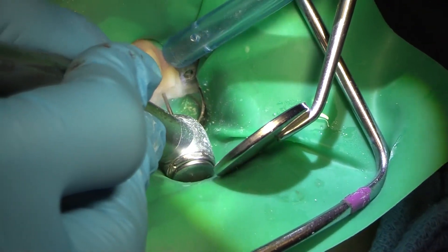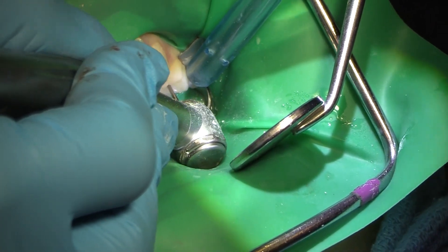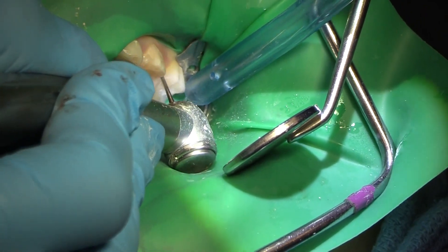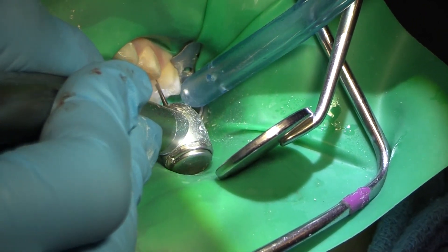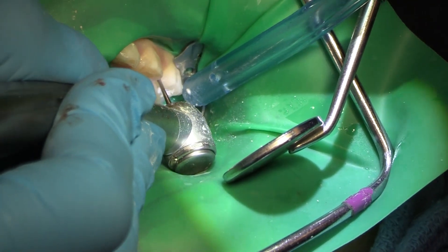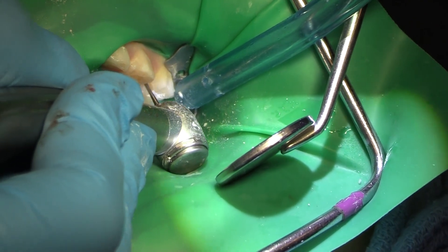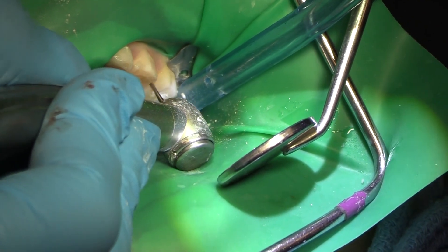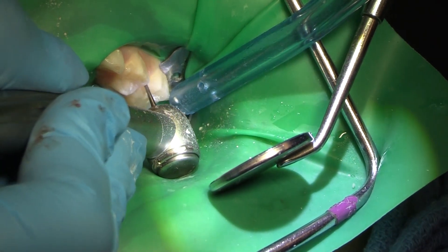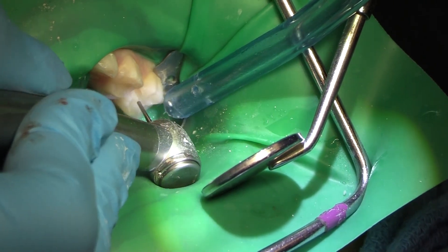Now I'm going to cut the MO of that tooth. The MO I know from the radiograph was not my biggest area of concern — my biggest area of concern was the distal, because I could see on the radiograph and clinically that it was quite a deep area. The MO should be cut without too much difficulty. I want to get down to the base, down to solid tooth. I don't want any decalcification, because that area is going to come back to bite us.